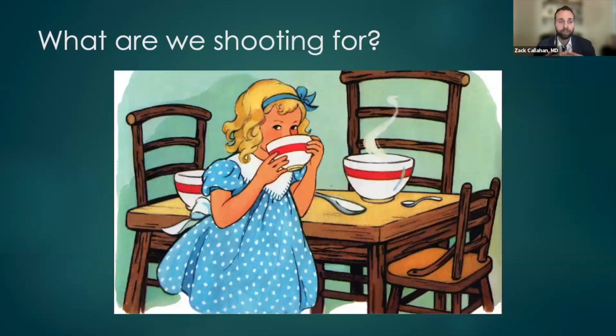And I have to admit, as someone whose favorite case in the world is to do a POEM, when you do an aggressive myotomy, yeah, it's a little fun. And when patients come back in clinic and they're so thrilled to be able to eat again, I think there's a lot of pressure to kind of try and open the GE junction as much as possible.